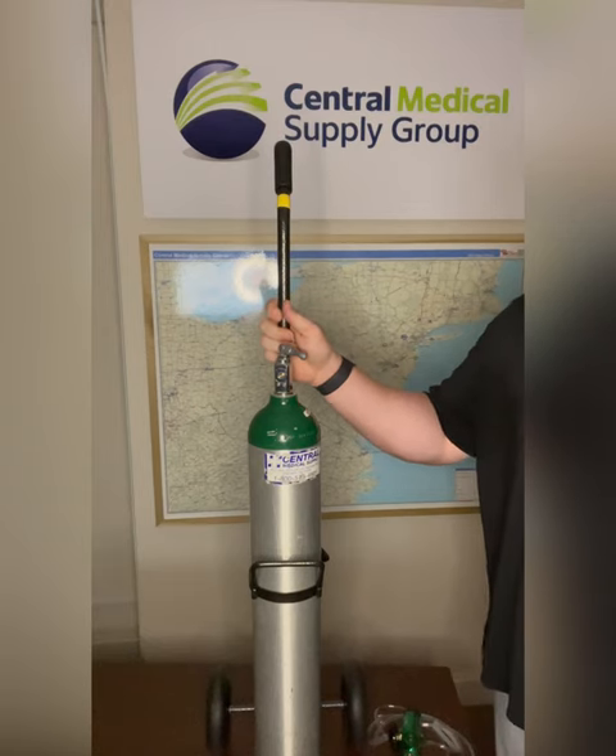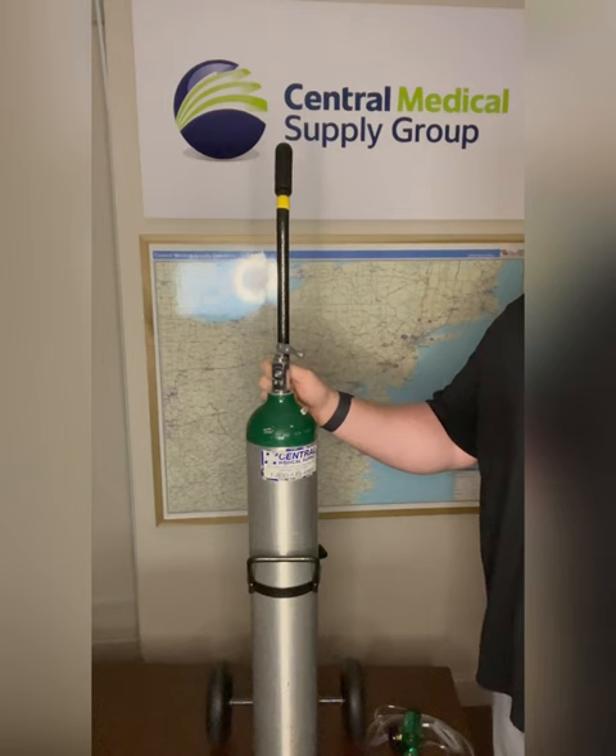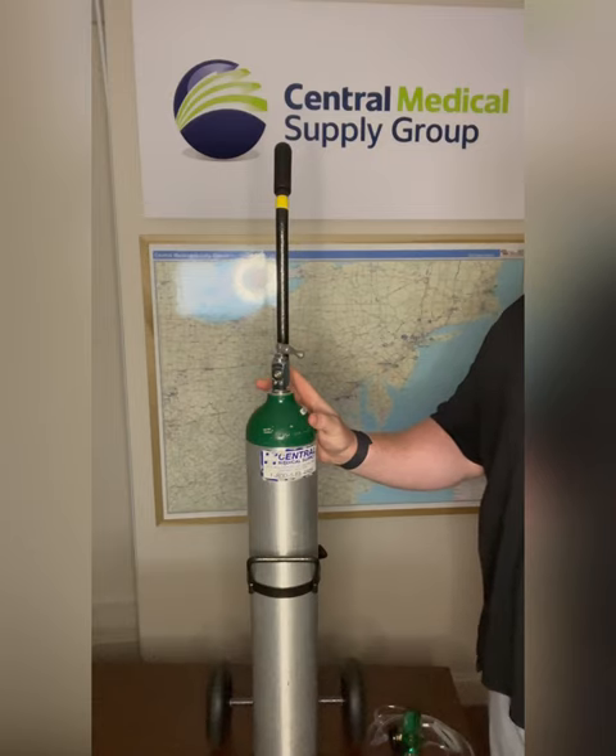Every backup E-tank comes with a rolling cart for easy maneuvering throughout the house or outside the home. It is also a safety requirement that the tank be secured in an upright position. And if you have multiple tanks at the home, we will provide a floor rack.